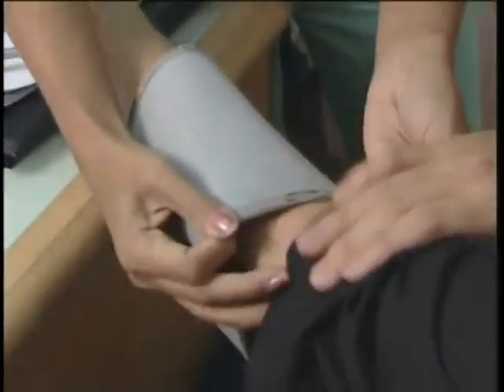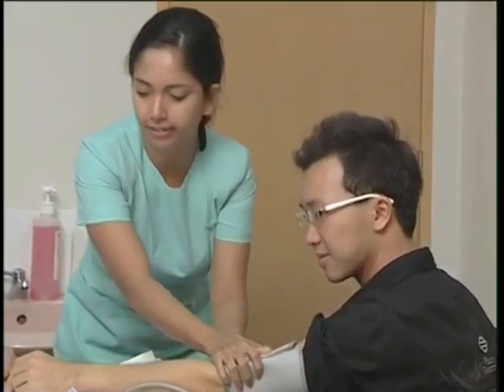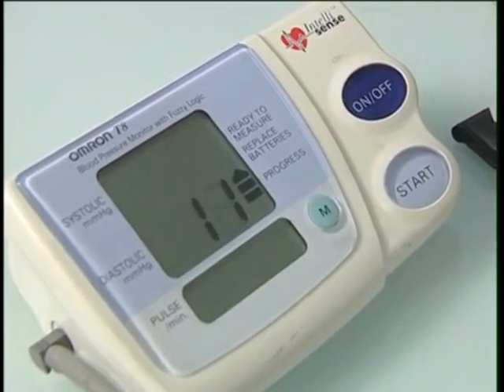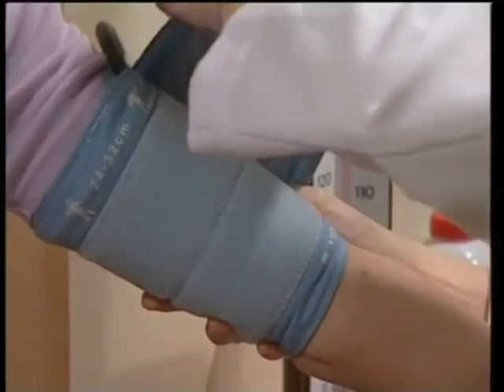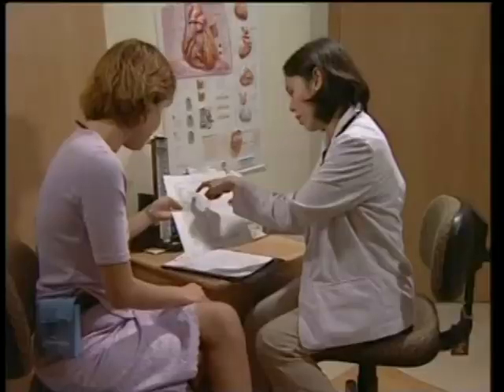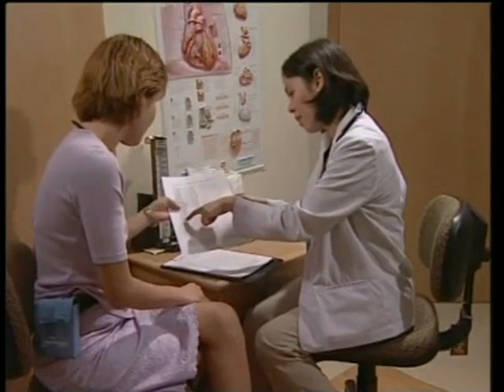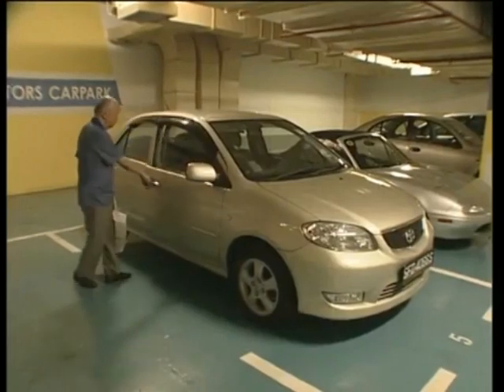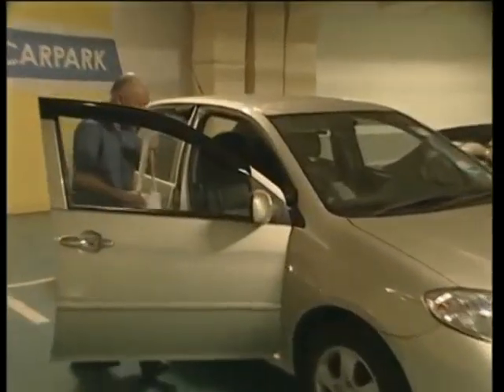When we look at a young person and measure blood pressure at the brachial artery, we find that the brachial pressure is very different — actually significantly higher than the central pressure. It can be as much as 30 millimeters of mercury. But when we grow older, the brachial pressure and the central pressure come closer together, which also means the vessels are getting stiffer.